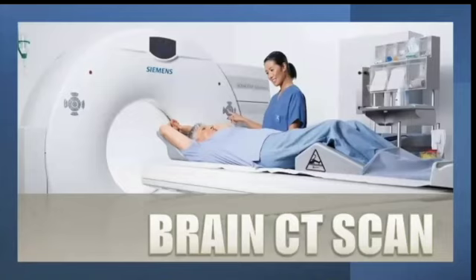By the end of this lecture, you will have a better understanding of how brain CT scans work, their indications, contraindications, risks, and benefits. Moreover, we will also discuss some simple principles of brain MRIs. However, kindly note that I am not a radiologist, so this topic does not fully fall within my range of expertise. So on this note, let's get started.